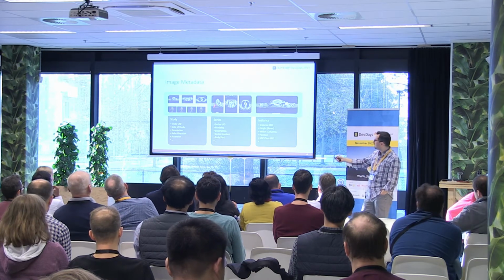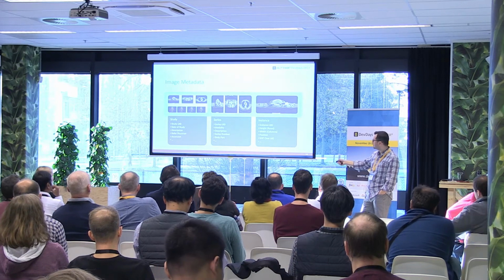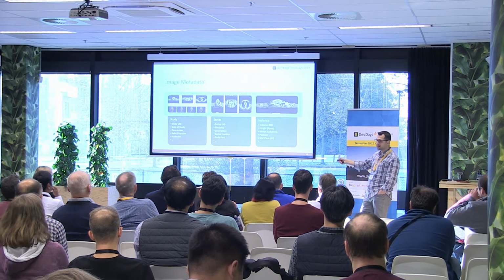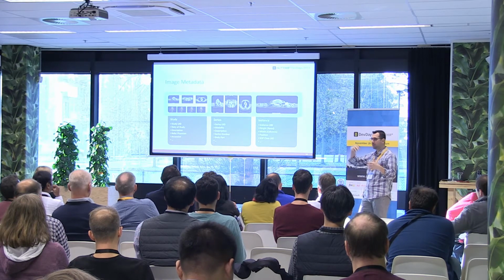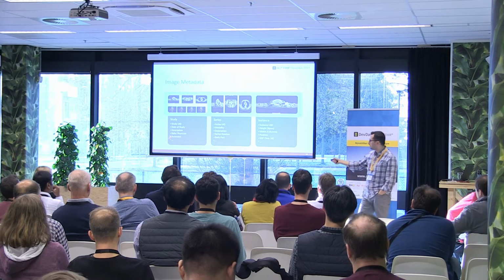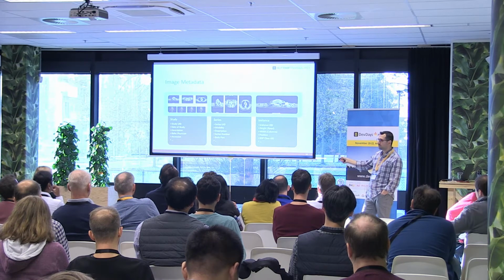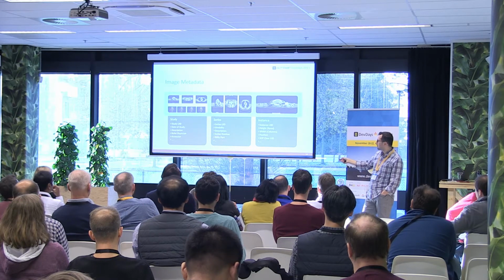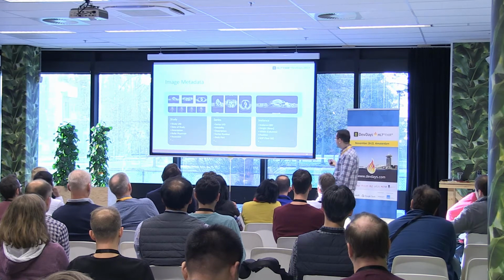Within the study, we have our series. So again, each one of them has a unique identifier. Each one has a modality, because remember, a study could have multiple modalities. So modality would be something like X-ray versus CT, which is CAT scan, or MRI, and so on and so forth. Each one of them would have a description. So there's an overall description of what they're trying to look for, and then a description of each individual scan that took place. A number of the series, and then the part that's being scanned, and of course there are even more attributes that you could discover later.